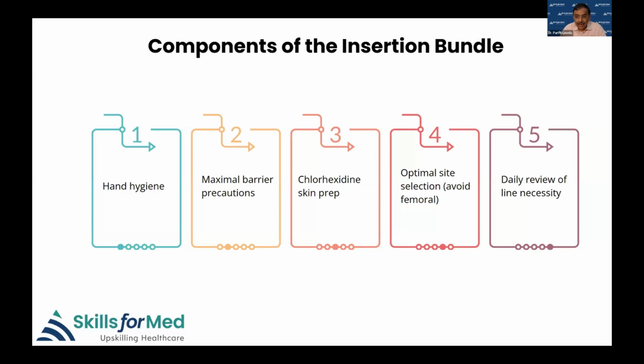What do you mean by that? One is the gown you're wearing also should be like the theater gown, or you should wear the theater gown, fully gowned and gloved, not just wearing sterile gloves alone. This is why this CLABSI rate is going up. Even though we know it is sterile, we are cutting corners by just doing a hand rub, and we are cutting corners by just wearing a sterile glove.